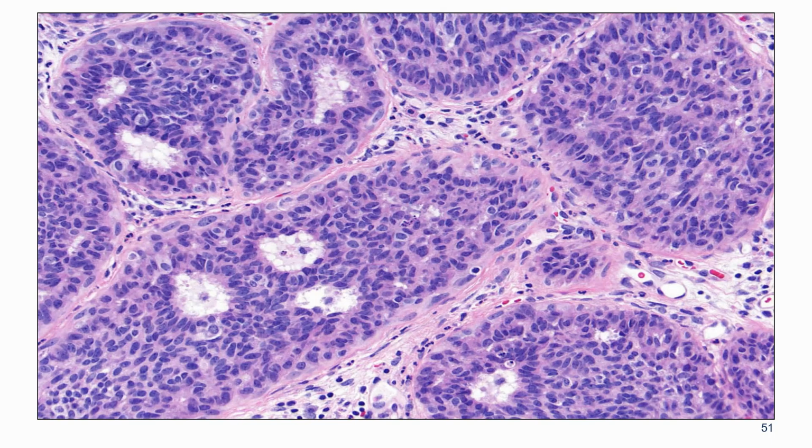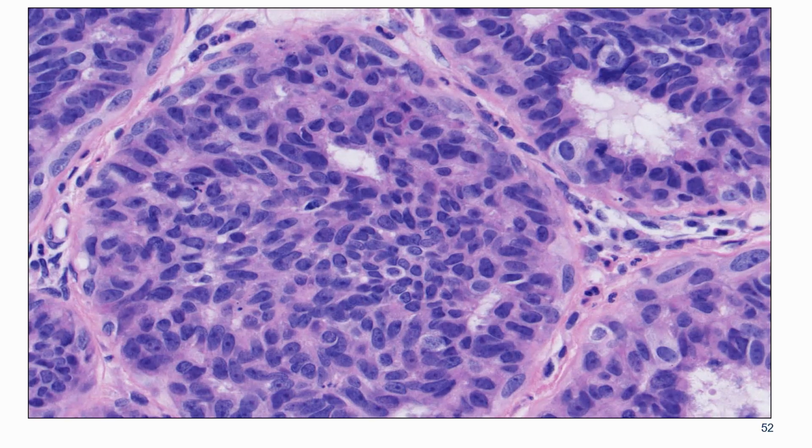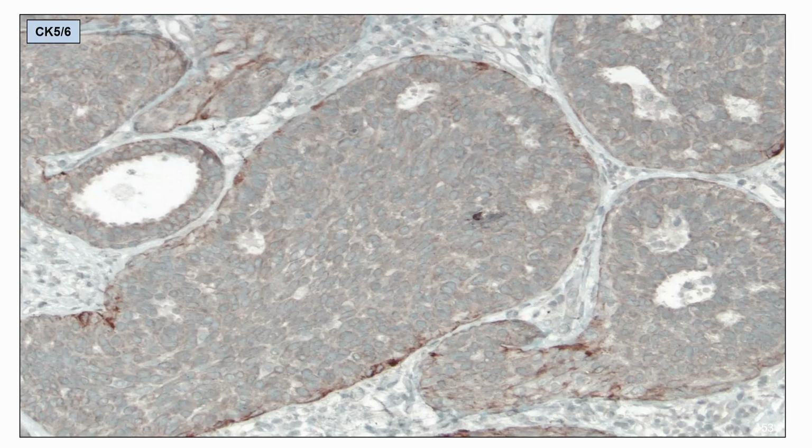But I think there's a little bit here. What I find very helpful, in addition to the monotony of the nuclear features and chromatin, is the presence of apoptosis. If you start to see apoptotic debris around and about, I would do CK5/6 and ER stains just to rule in or rule out UDH and DCIS.